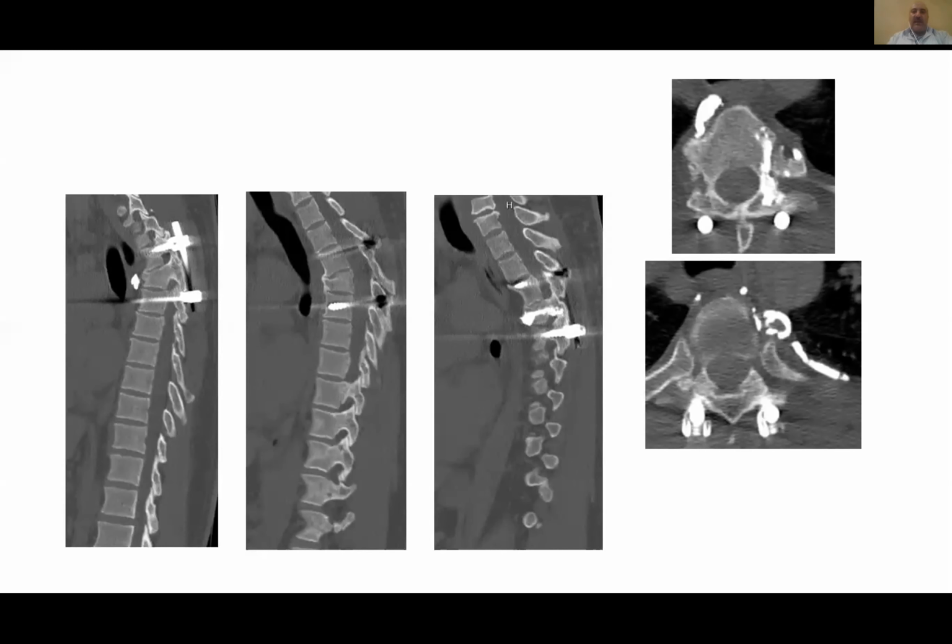The other thing I want to mention about vertebroplasty, especially in the upper thoracic level, is that it is totally different from the lower thoracic and the lumbar. If you want to start with kyphoplasty or vertebroplasty, you have to start with the lumbar, which has easier levels, till you master it. Then you can go step by step to the lower thoracic, then to the upper thoracic level.